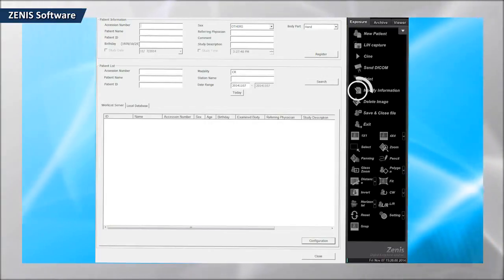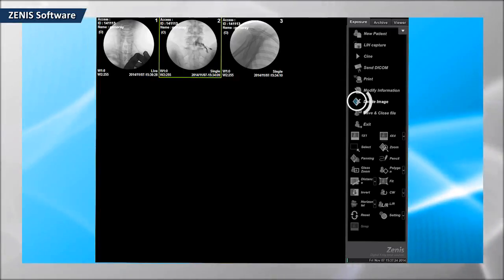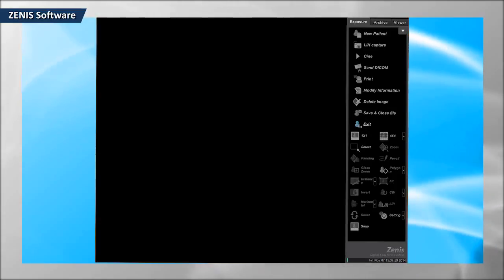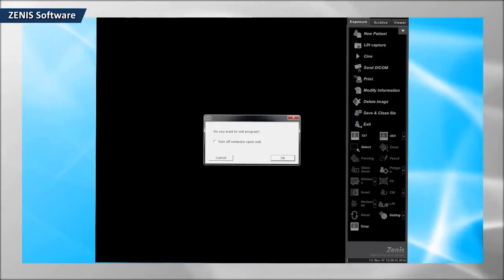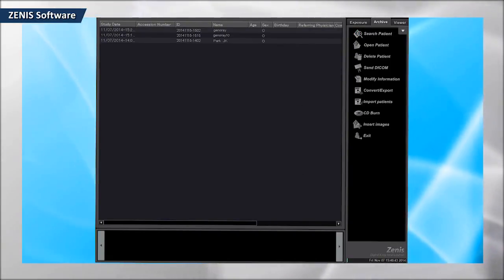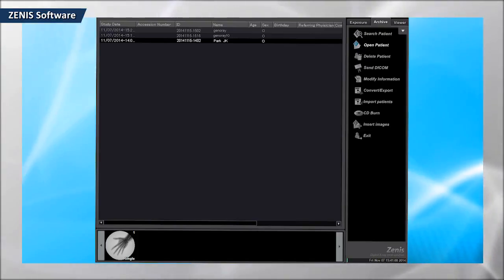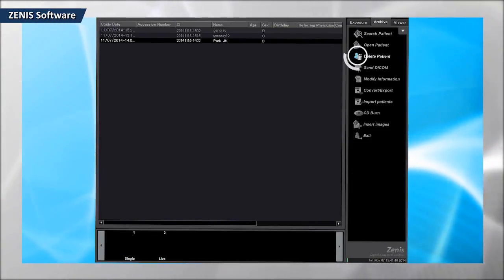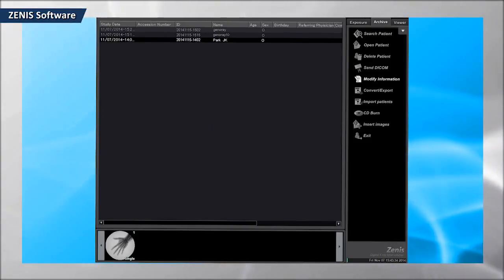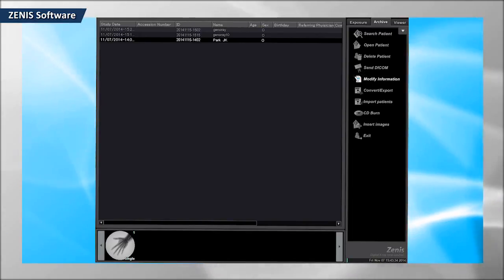Click on this function when changing the patient information. Unnecessary images can be deleted using the video delete function. When filming is done, click on the patient's close function to end the process. Search the stored patient information using patient search, then import information using the patient open function. Click on the delete function when deleting patient information. Video transmission and patient information change can also be done in a video storing mode.